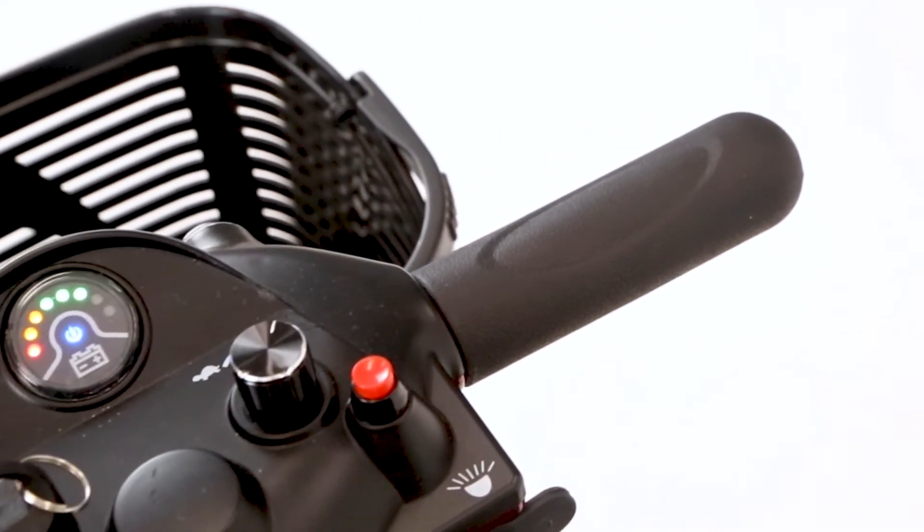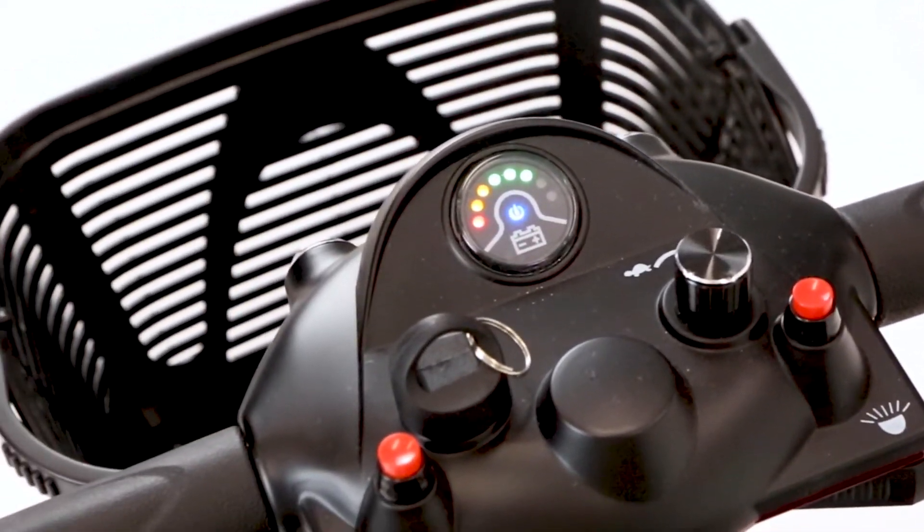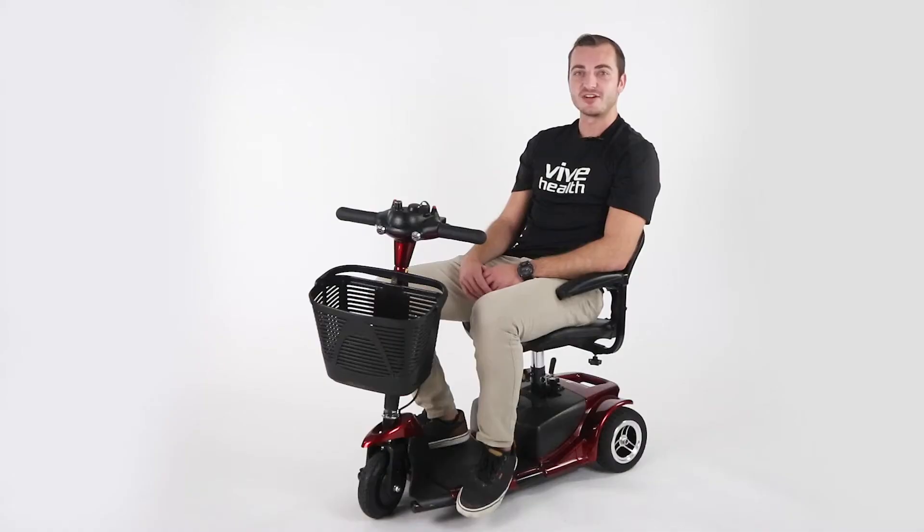It uses two 12-volt batteries that give it a range of roughly 12.4 miles and a max speed of 3.7 miles per hour. The battery can be charged while attached to the scooter, or it can be removed for convenient off-board charging.